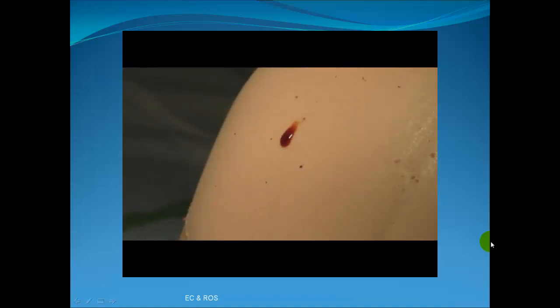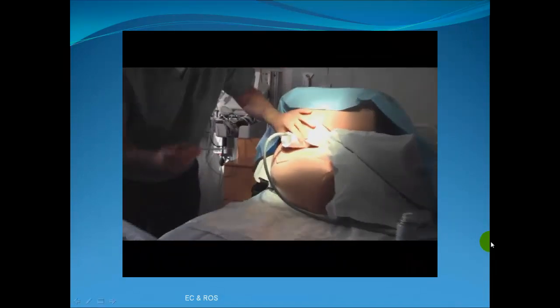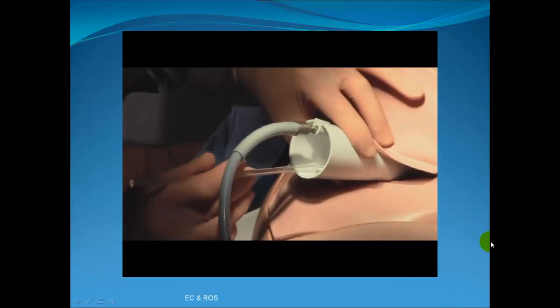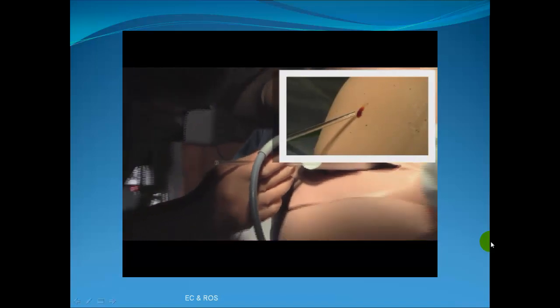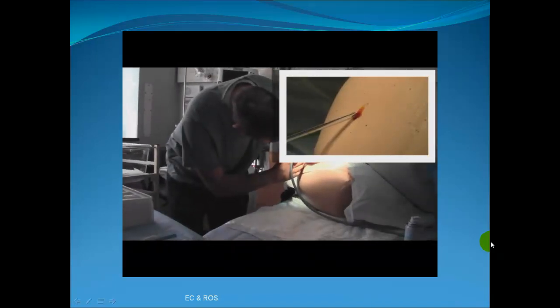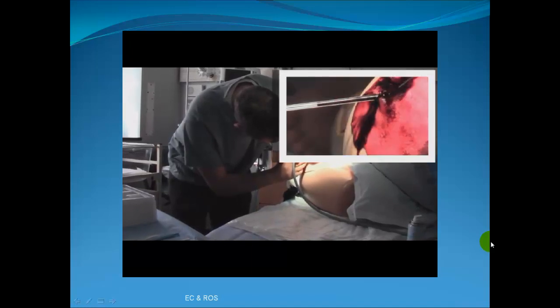Now, place the capillary tube just against the bleb. This allows capillary action to fill the tube. It takes 50 microliters, approximately 3 centimeters on the capillary tube, for a valid fetal blood gas sample. If possible, take 2 samples so that results can be correlated. Or if one sample contains air bubbles, for example, the second sample can be used.